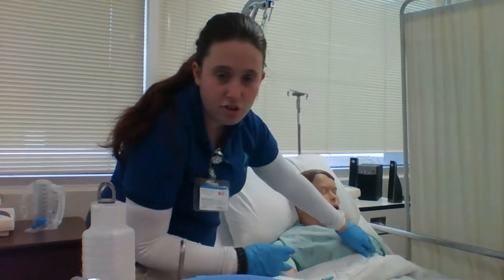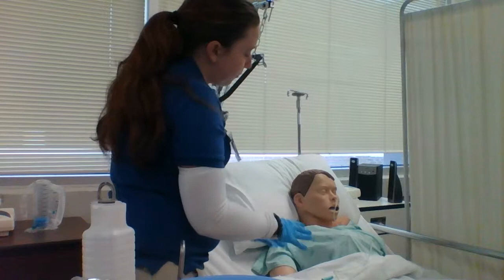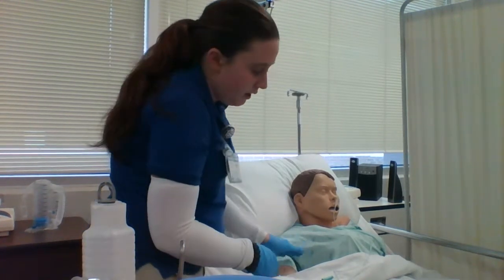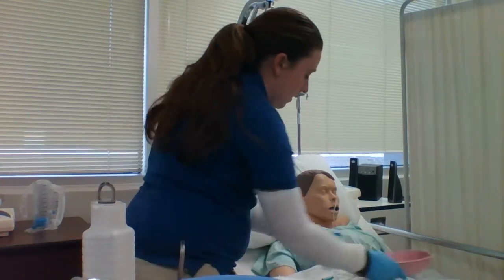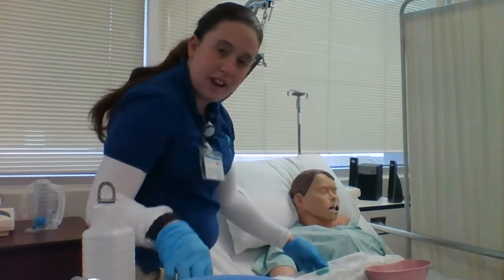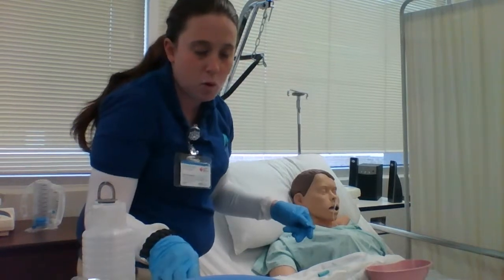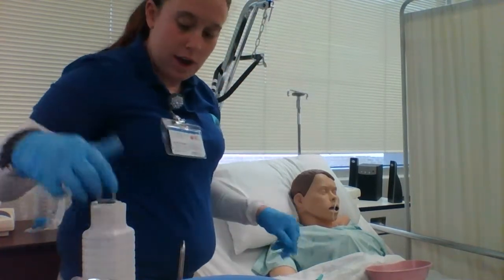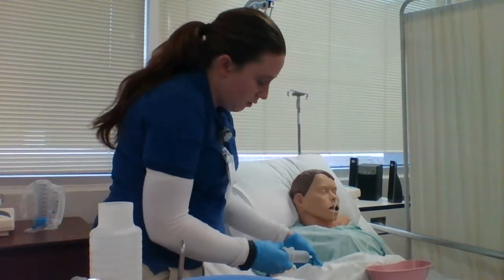Placement has been reached, and now I would do the verification of placement. Can you say something for me? Okay, patient was able to speak. Next, I would check the back of the throat. Okay, there is no coiling in the back of the throat. Next, I would go ahead and aspirate for gastric fluid.